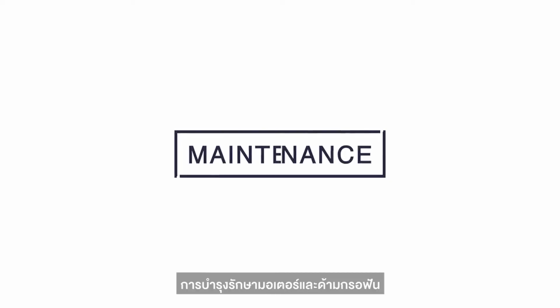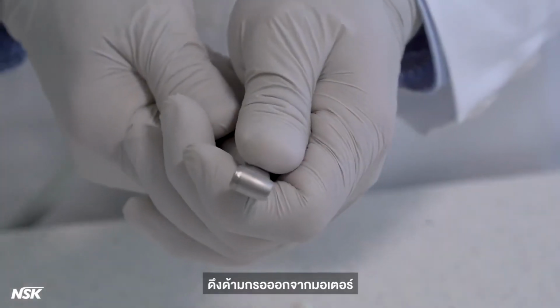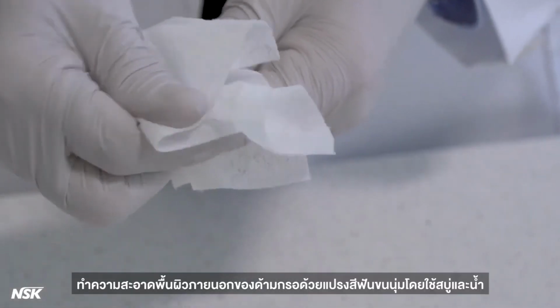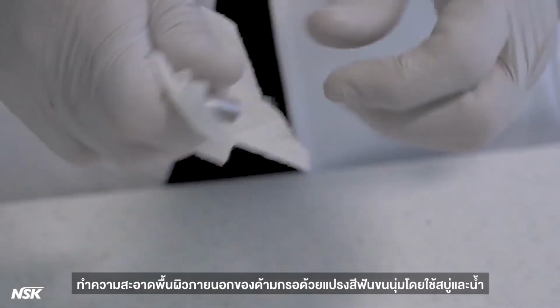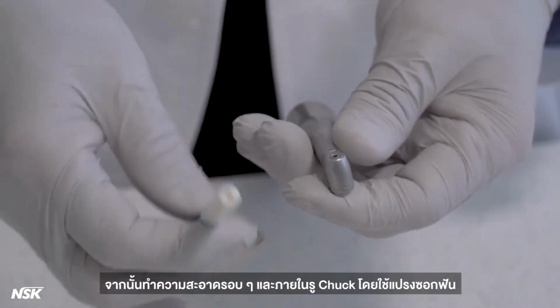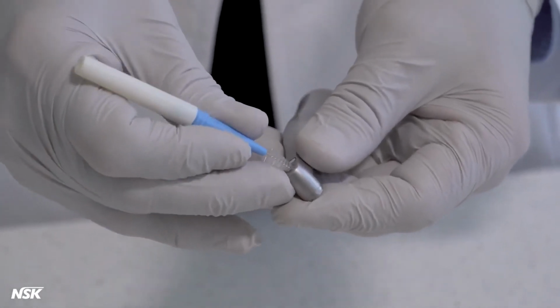Maintenance of the motor and the attachments. Remove the burr. Disconnect by gently pulling the attachment out of the motor. Clean the external surface of the attachment with a soft toothbrush using soap and water, or use a cleaning wipe or alcohol. Then, clean around and inside the burr insertion hole using an interdental brush.